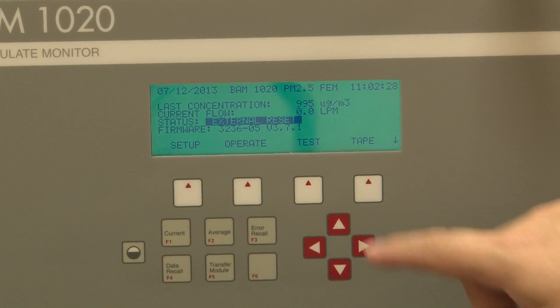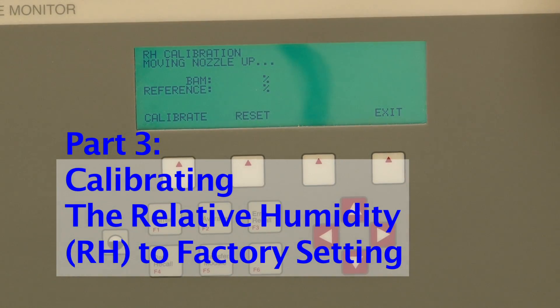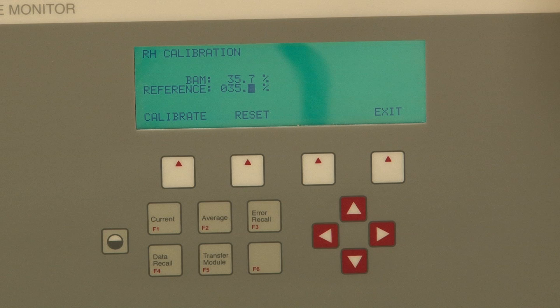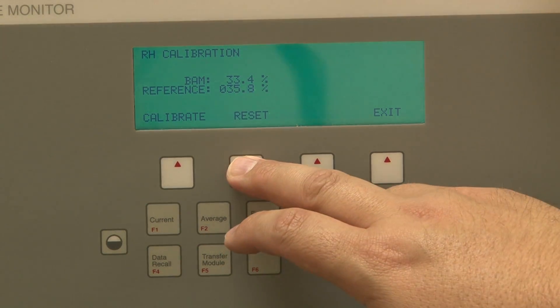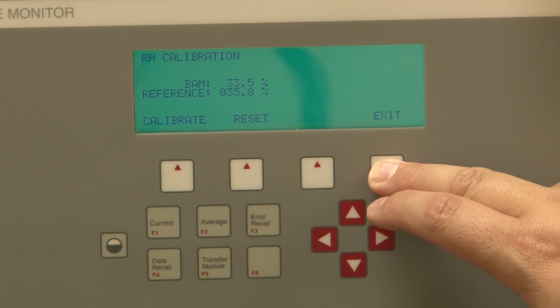Once you've calibrated the flow, you're going to come back out here to Test and move down to Relative Humidity — RH — and hit Select. Here you do not want to hit Calibrate; you want to hit Reset. Calibrate is a long process that will take more time than needed. The factory reset will set it back to 35%, which is where we want it to be. So we come in here and just hit Reset, and it'll reset to basically 35%. Then you just hit Exit.